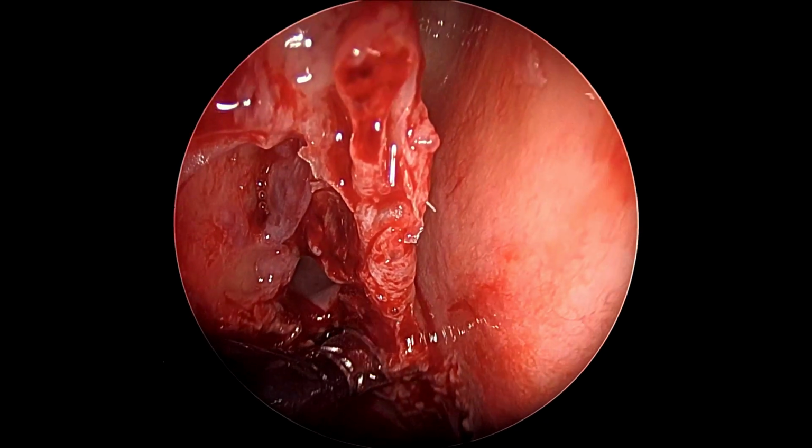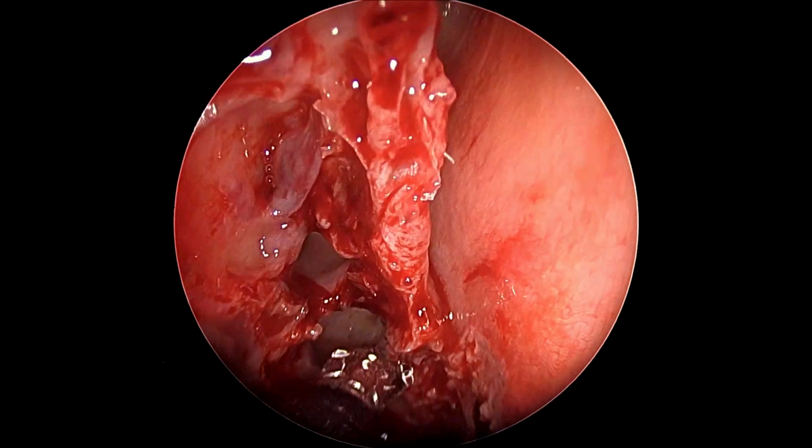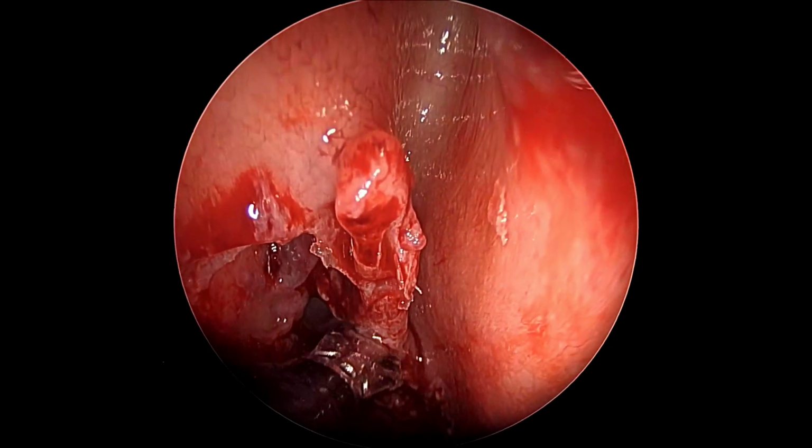So once again, here we are enlarging the ethmoidal cavity even more, trying to take down septations and coagulating the mucosa.